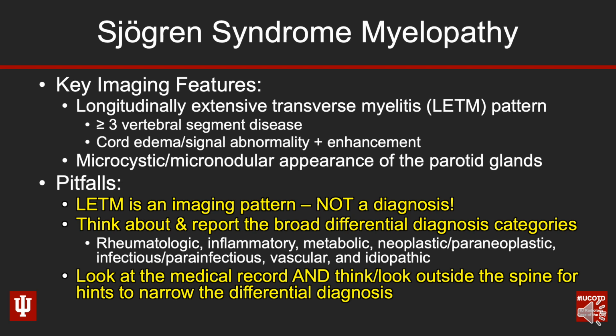And I think it's really incumbent upon the interpreting radiologist to dig into the medical record, as well as to think and to look outside of the spine for those helpful hints that may help you narrow down your differential diagnosis and give something that's more specific to that patient's presentation.